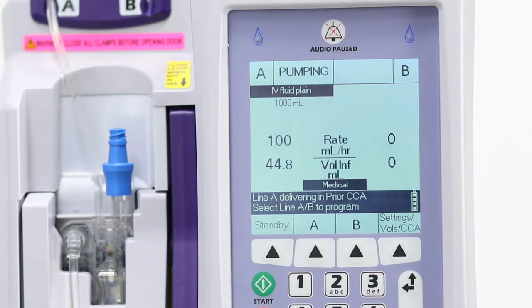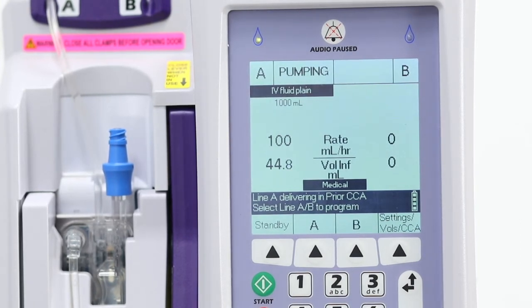Until a VTBI complete alarm sounds, the pump is still infusing under the old CCA.